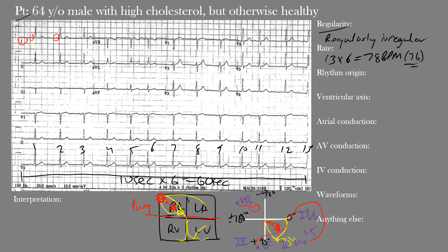Looking at the EKG: lead I shows upright P waves, lead II shows upright P waves, AVF shows upright P waves in those inferior leads. Moving to the left lateral precordial leads — V4, V5, and V6 all show upright P waves. And in AVR we can see inverted P waves. Additionally, for sinus rhythm we need a P wave before each QRS with a one-to-one ratio. Looking through the rhythm strip, there is always a P wave before each QRS complex, so we meet all the criteria for sinus rhythm.